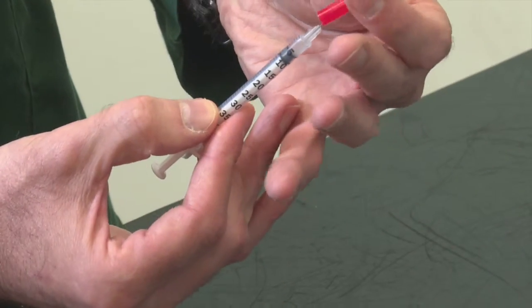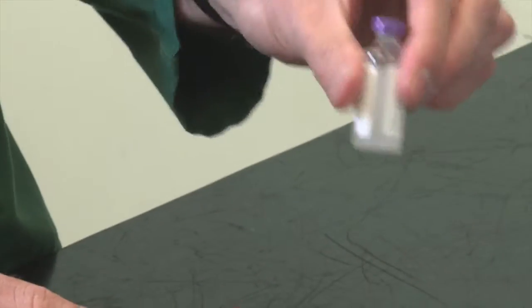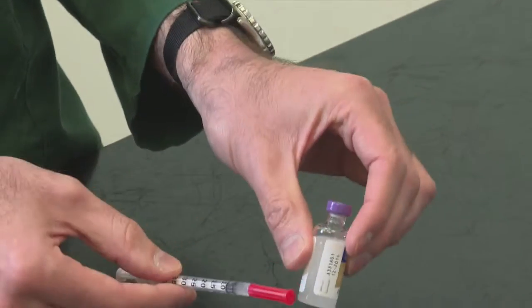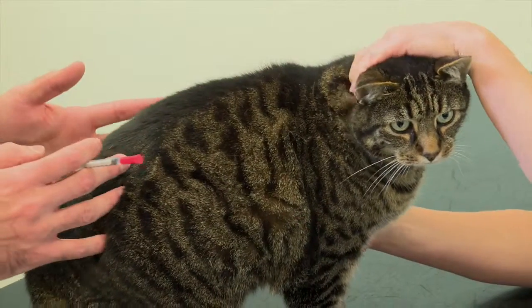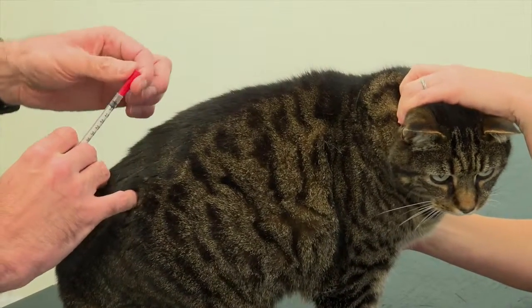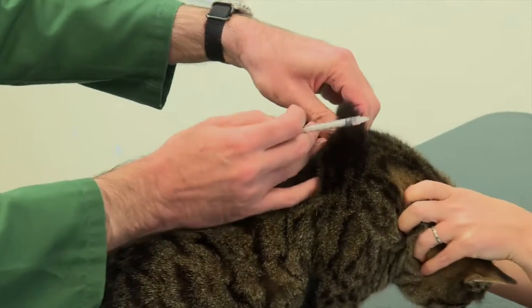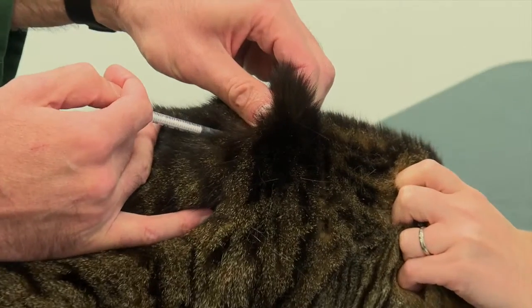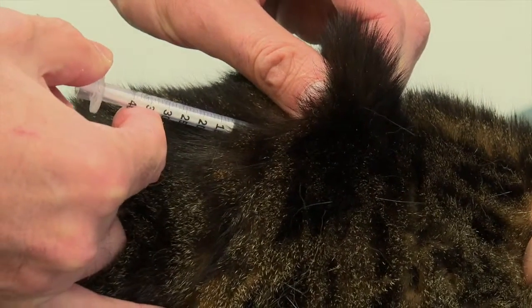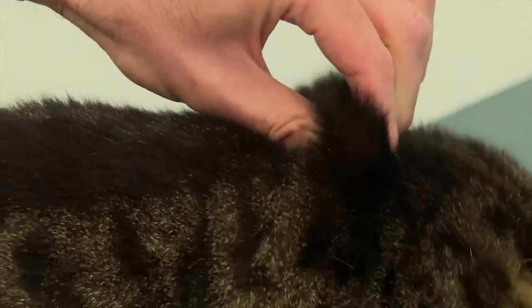Put the cover back on so it is safe — be careful when doing that as it is very easy to prick yourself. Then put your insulin bottle back into the fridge. We now have the patient and we are going to inject the 5 units of insulin. Take off the needle cover, make your tent, go in up to the hilt, draw back making sure there is no blood, give a nice smooth injection, and a little rub afterwards.